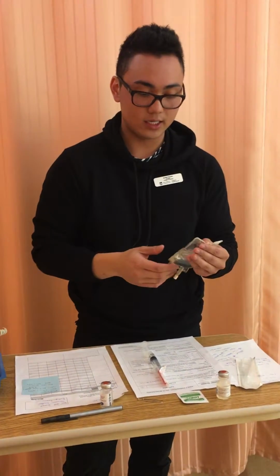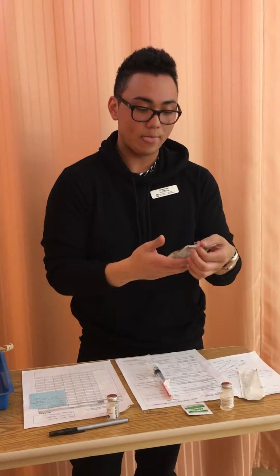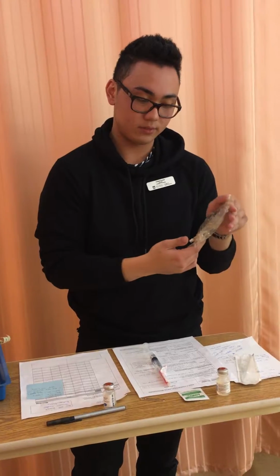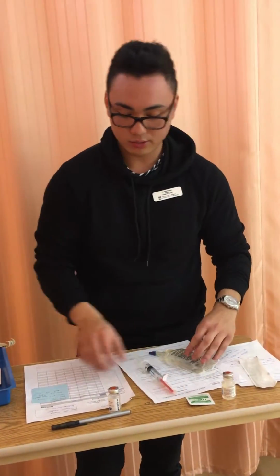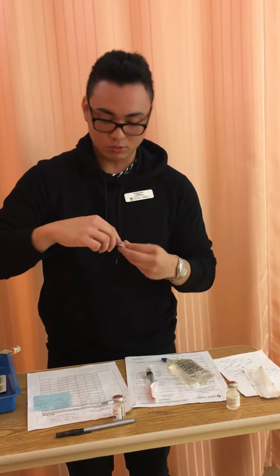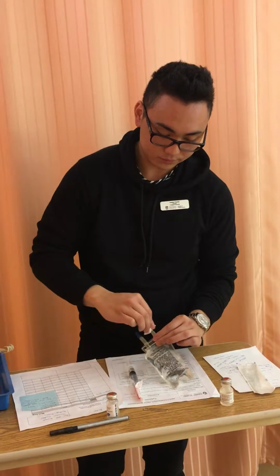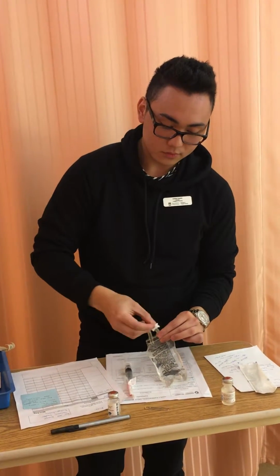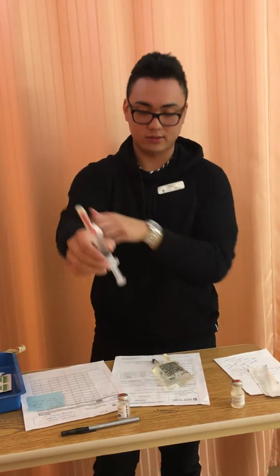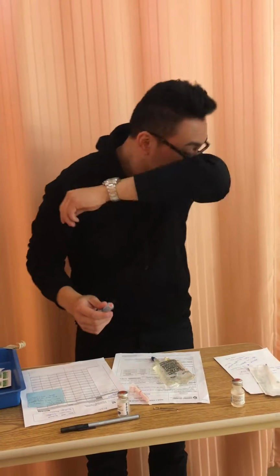But before we put the medication in, we just have to check the integrity of the bag, making sure that there are no foreign particles, making sure that it's the right formula that we're using here. So before we instill our medication in there, we will swab again. So 30 seconds. Let it dry for 15 seconds. Okay, 30 seconds passed, and then 15 seconds also passed to dry. Now we will instill our medication.